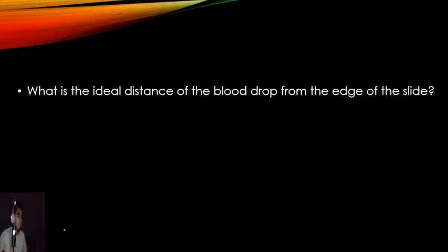Alright, so next question. The ideal distance of a blood drop from the edge of the slide is 1 centimeter. Sir, will they still ask this in the board exam? Yes, they ask it in the board exam.